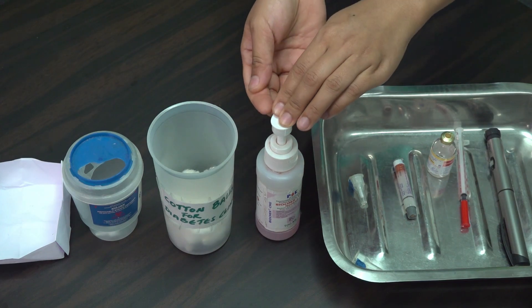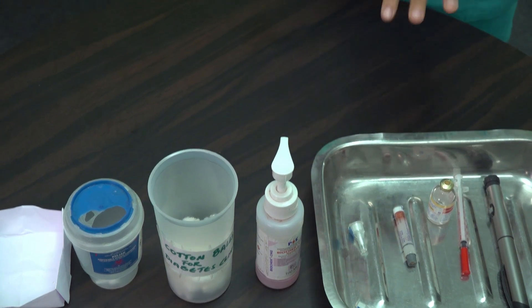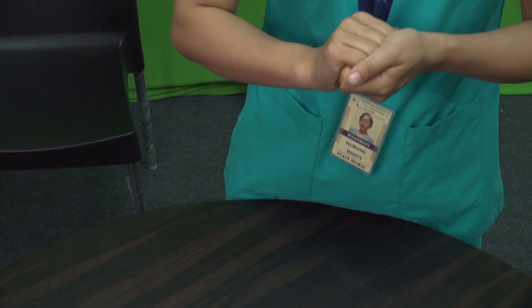Wash hands thoroughly with soap and water for at least 20 seconds. If unavailable, use a 60% alcohol-based hand sanitizer.